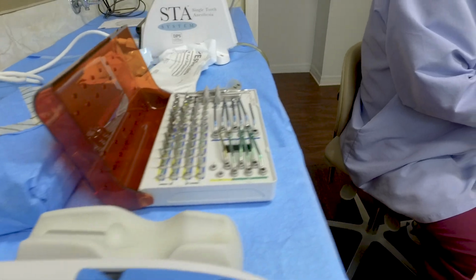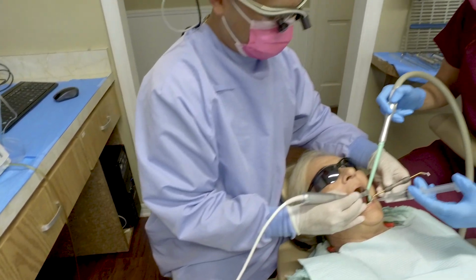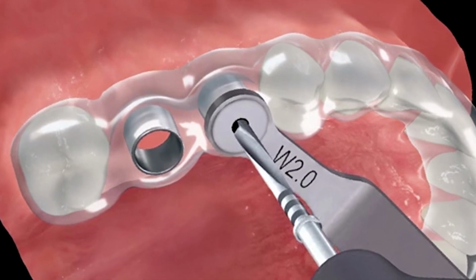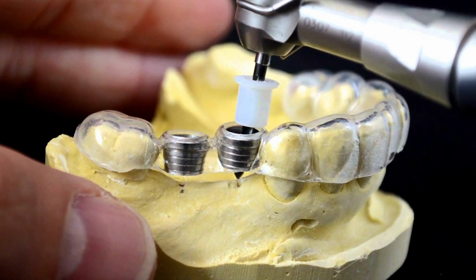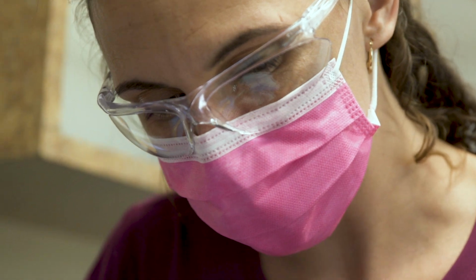So when someone's missing a tooth and we are placing an implant, there are various ways to achieve the actual surgical placement. And one of the ways is a surgical guide. A surgical guide is like a stent. It's something that helps us and guides us, as the name suggests, into the proper angulation and proper depth, so we get a more accurate and more efficient placement of the implant with minimal post-op issues, and it's just more predictable that way as well.